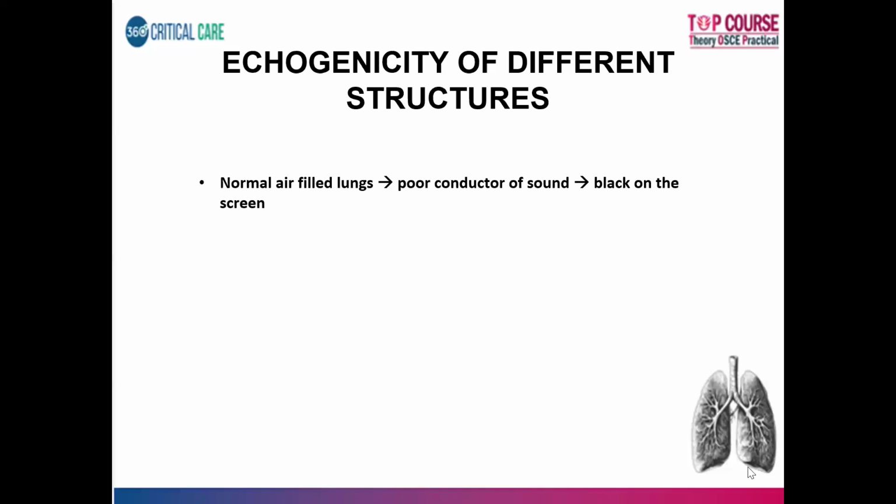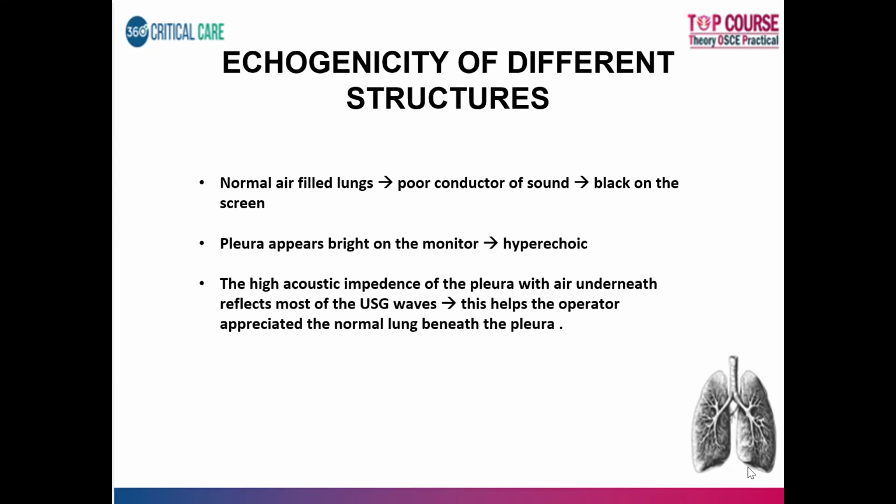So you just see it as a black screen on the monitor. It will just appear as black. So pleura appears bright on the monitor. It is hyperechoic. The acoustic impedance of the pleura with the air underneath, which reflects the ultrasound waves, helps the operator distinguish between a normal lung and the pleura.